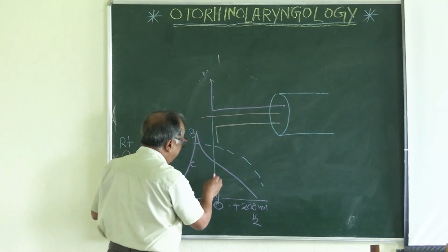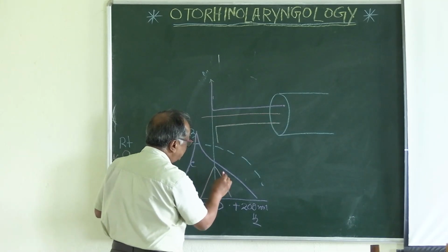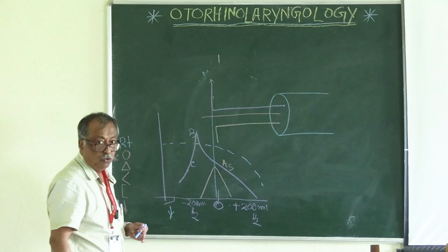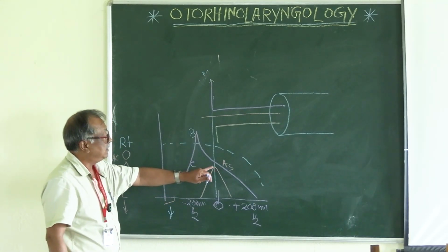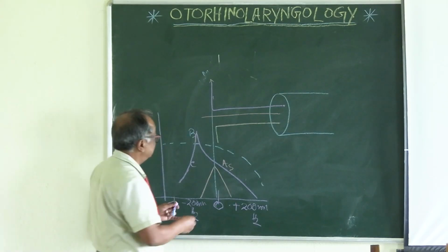Now, in A, it is a short A known as AS. Though I do not believe, some say the AS sometimes represents the otosclerosis.